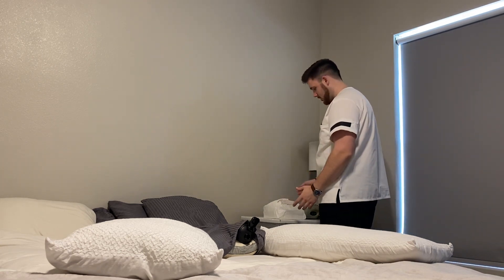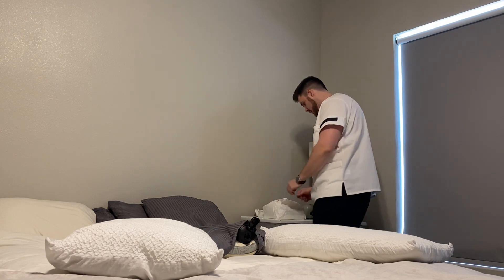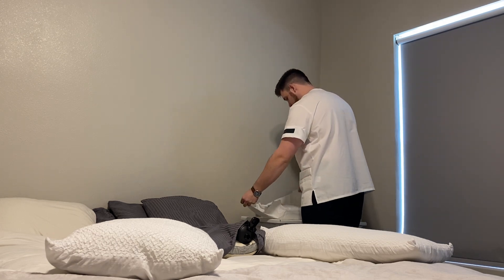It's a little smaller than normal, so my gloves will touch my sterile field. In reality, they would not. Make sure you stay on the one-inch border.